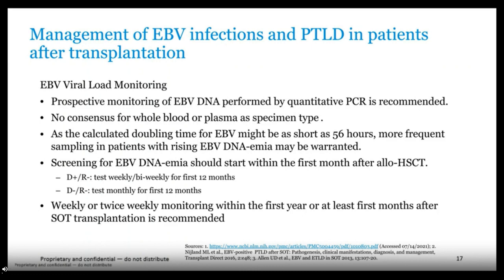The frequency with which you may want to monitor these patients is dependent upon the donor and the recipient status. Those patients that receive a donor-positive organ where the recipient is negative are at highest risk for developing PTLD, and they should be monitored more frequently than those where the donor is negative and the recipient is negative. Weekly or twice weekly monitoring within the first year, or at least the first months after solid organ transplant, is recommended.